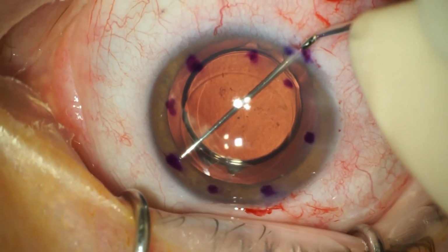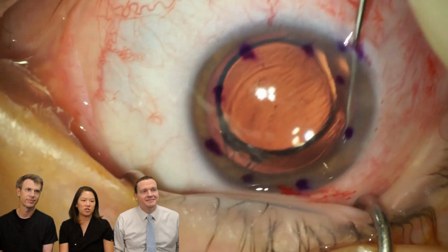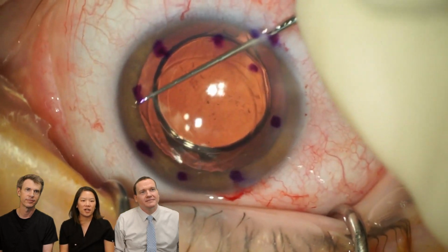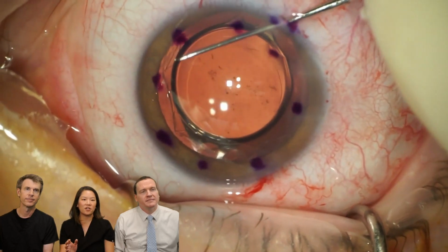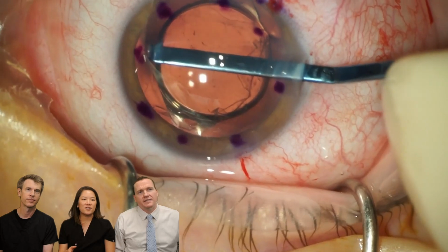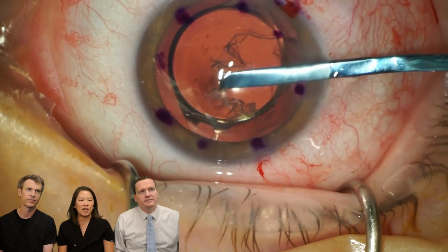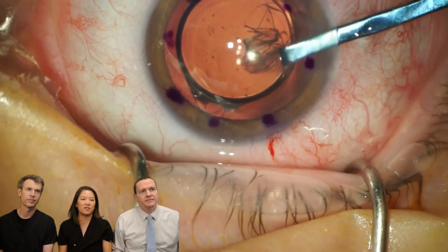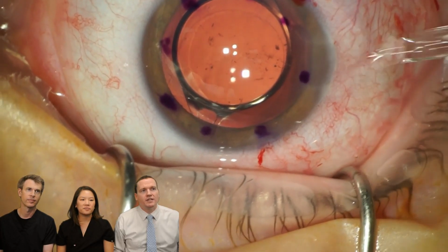So moving on, this is an actual video of a DMEK. So right here you see a scoring process. We're actually scraping the posterior portion of the cornea, trying to catch a lip to detach Descemet's there, and you can see that little fold. It's starting to come away. And then this is a very delicate portion where you're just trying to not cause any roughening of the stroma. You're trying to just isolate that Descemet's, and you can see it's bunching up. We're going to pull it out here, and there you go. Two little pieces. Yep.